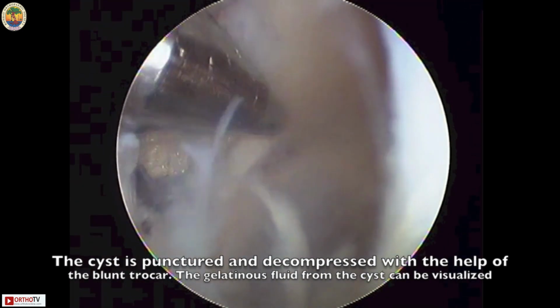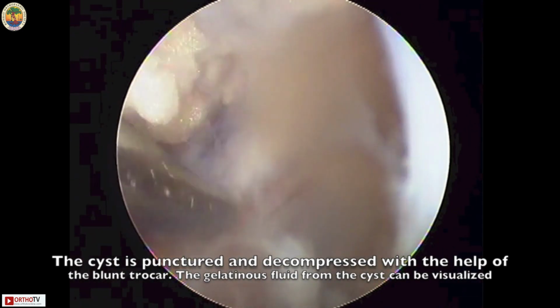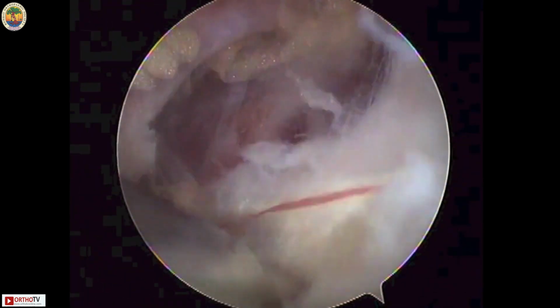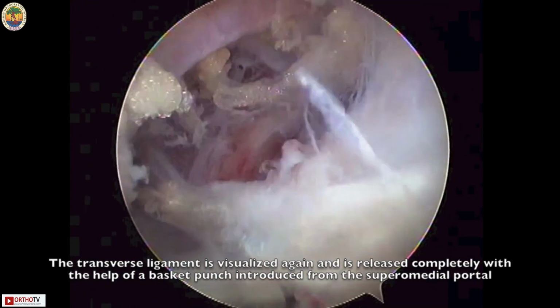This cyst is punctured and decompressed with the help of the blunt trocar. The gelatinous fluid from the cyst can then be visualized escaping from the cyst. The ligament is visualized again and tissues are separated medially and laterally at the notch.